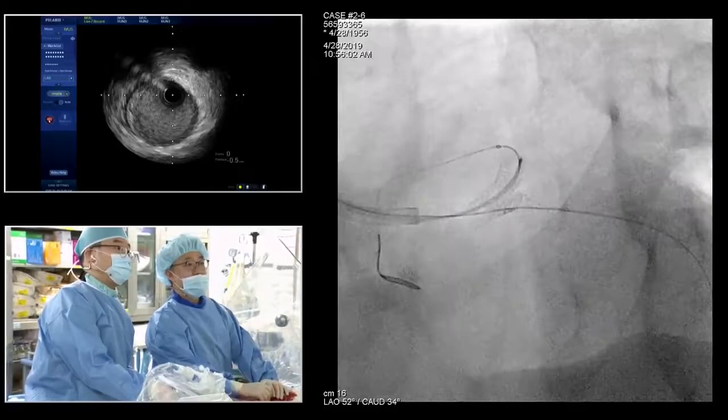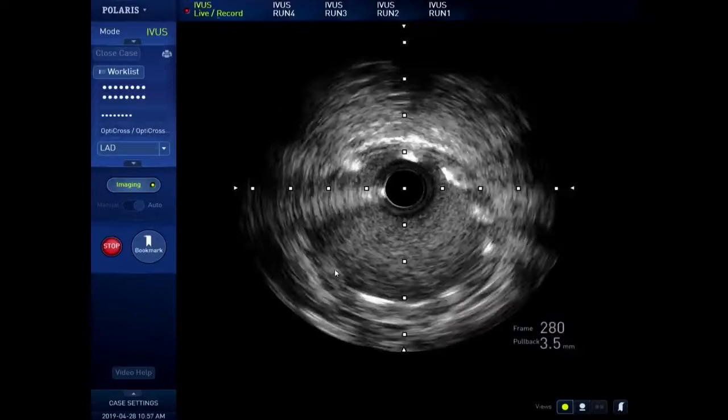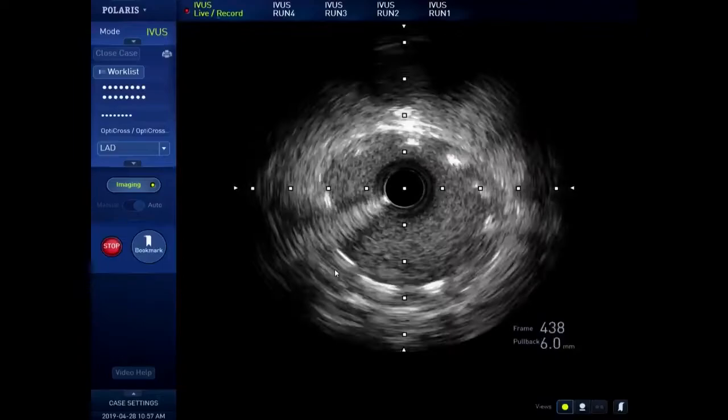Okay. Gary, one of the questions regarding the new Polaris system for the Boston, is any comment regarding that compared with the old system? Well, it's a higher frequency transducer and the software is better. You try it, you make sure you like it, and then you get rid of the old stuff.